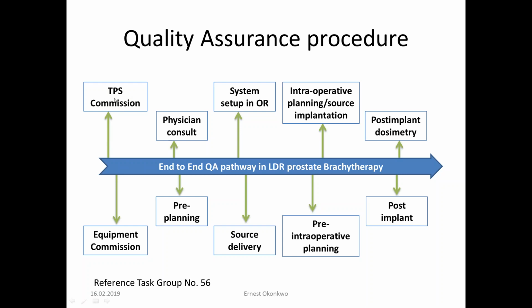Here you have the treatment planning system commissioning. You have the other equipment commissioning, like the stepper and the ultrasound. Then you also have the physician consult. What I try to show here is that brachytherapy is teamwork. It's not just left to the physician. You have different professional groups interacting with each other.